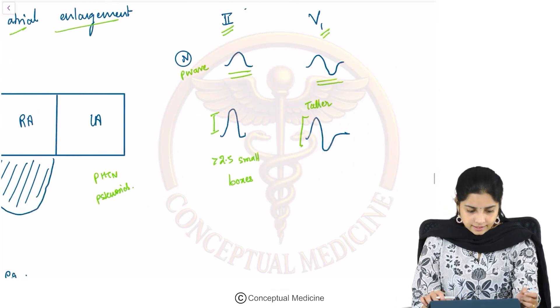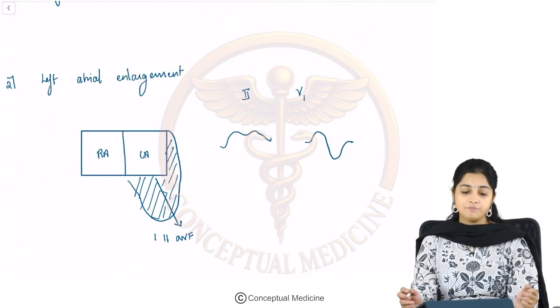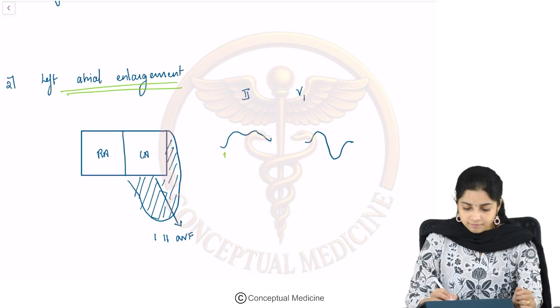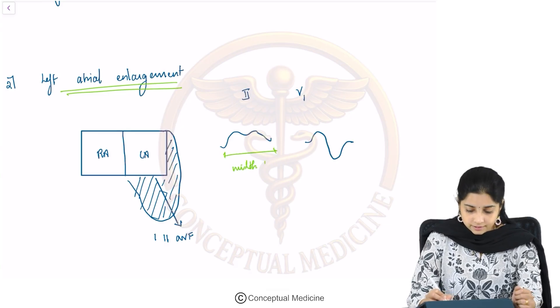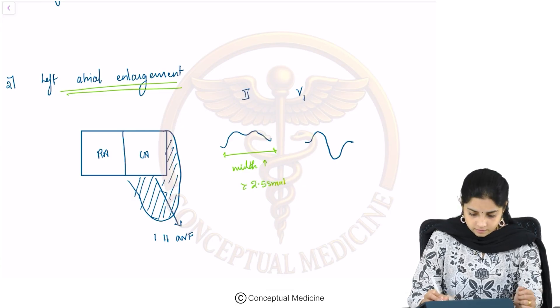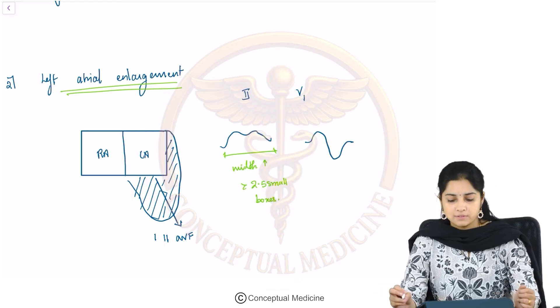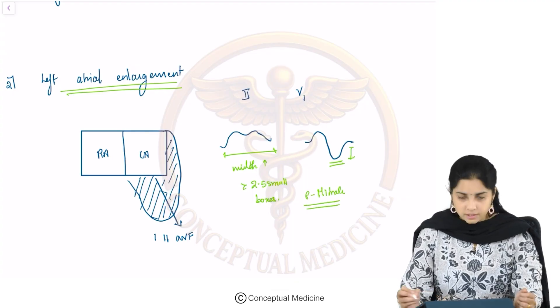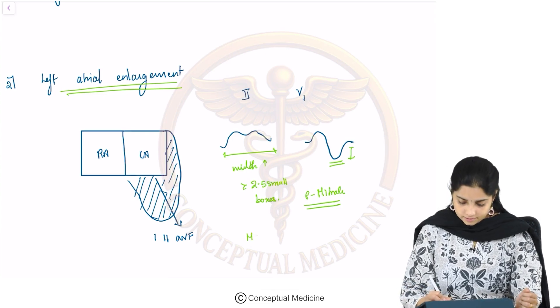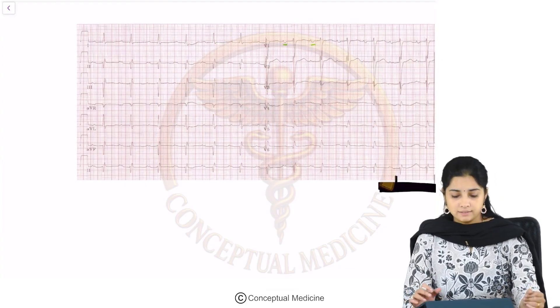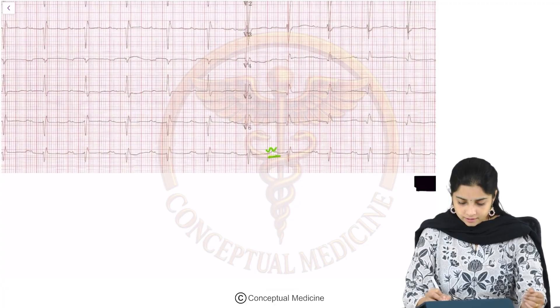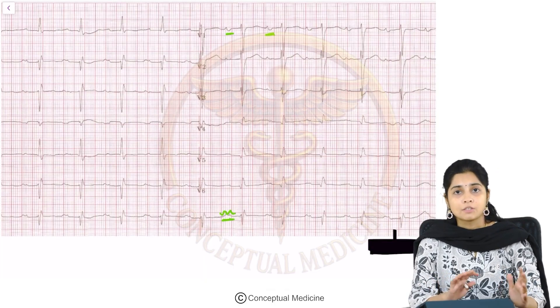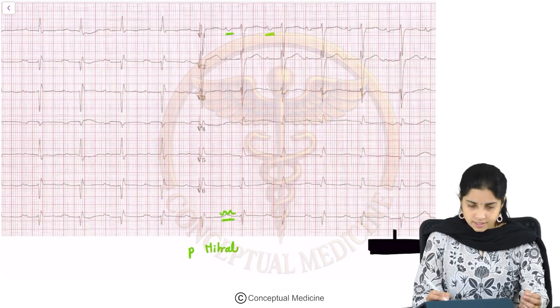Now let us look at the second abnormality — left atrial enlargement. When there is a left atrial enlargement, the P wave width increases to more than 2.5 small boxes, or the second portion is more deep. This is what we call P mitral, seen in mitral stenosis. Looking at this ECG, you can see a wide P wave with a hump-like appearance, and in lead V1 the second portion of the P wave is much deeper.